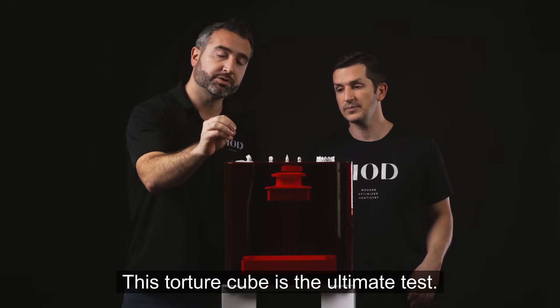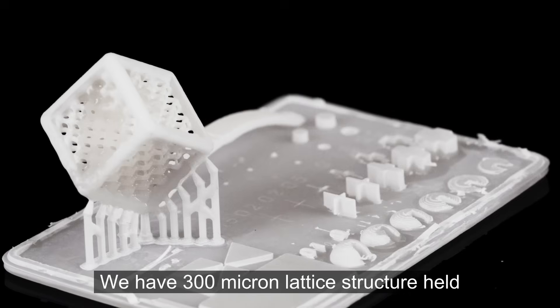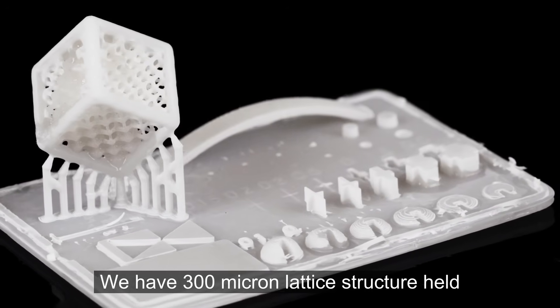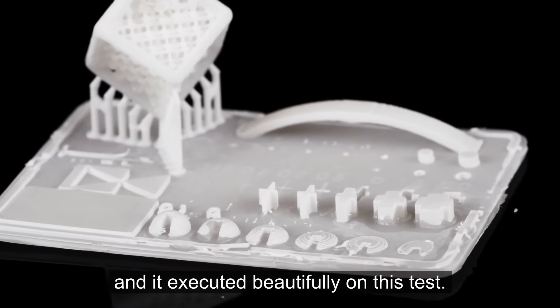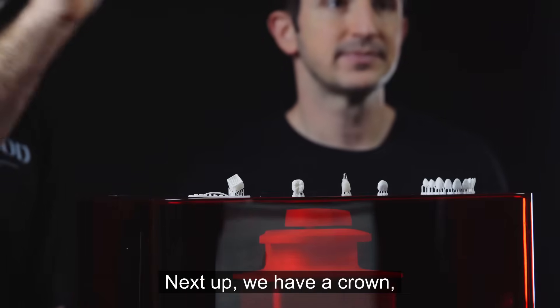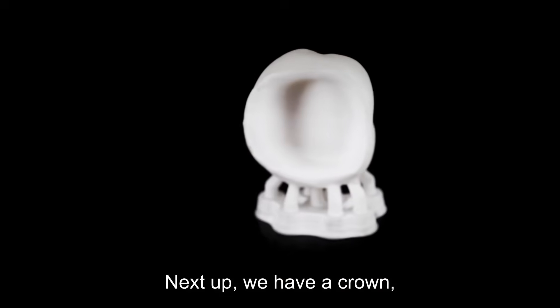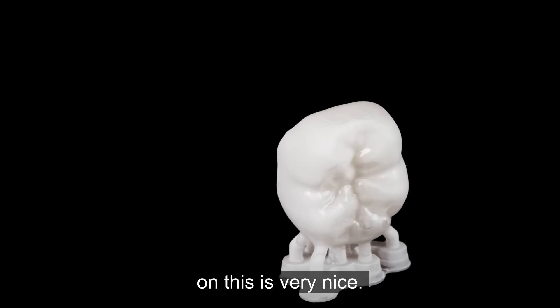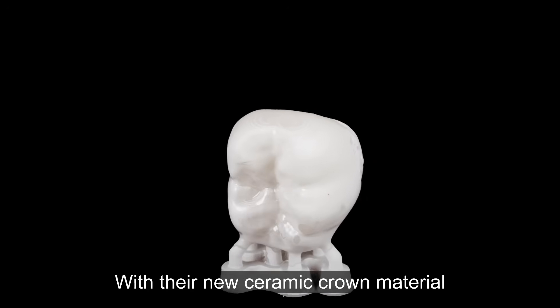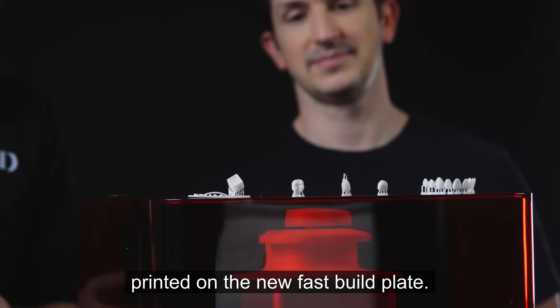This torture cube is the ultimate test. We have a 300 micron lattice structure held up by ultra tiny supports and it executed beautifully. Next up, we have a crown, which is a really popular thing that most people would print in their office. The anatomy and detail on this is very nice with their new ceramic crown material printed on the new fast build plate.